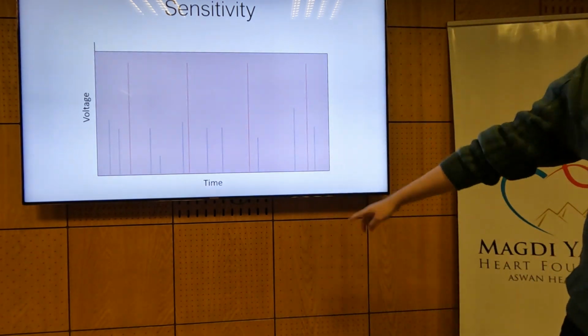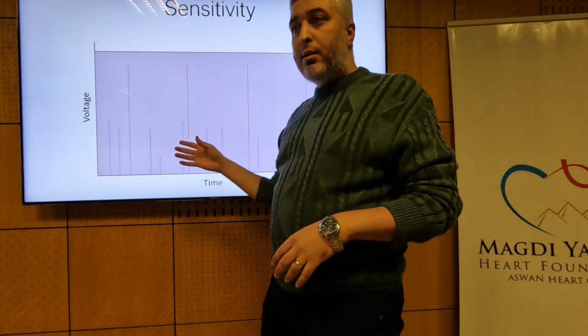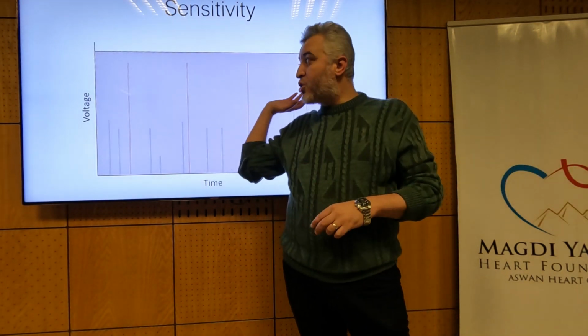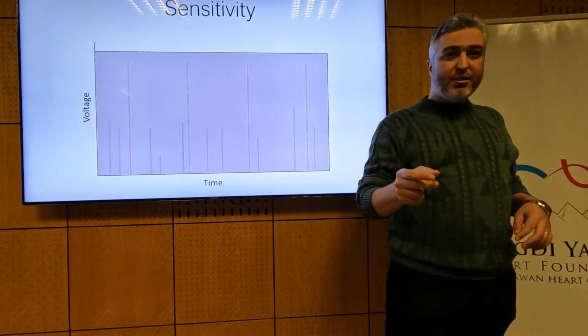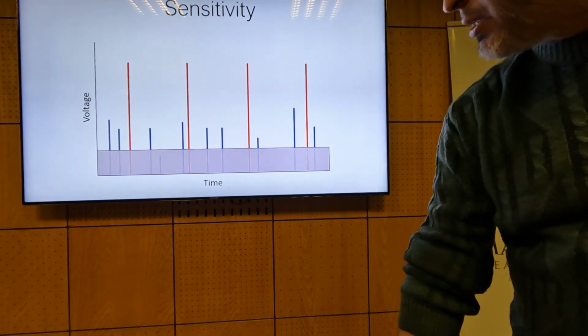What happens if we do this? You ignore ventricular activity, and then you've actually turned the VVI into a VOO. So you consider there is absolutely no ventricular activity, yet there are spikes there, and you keep pacing all around. Okay? And what happens if you do this?